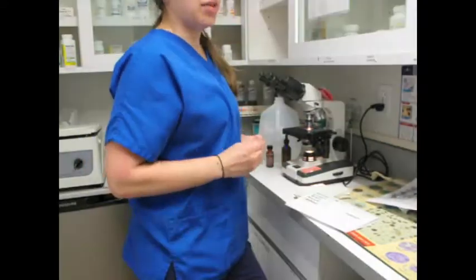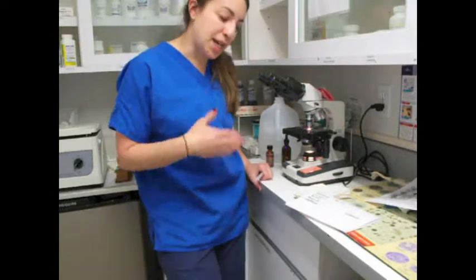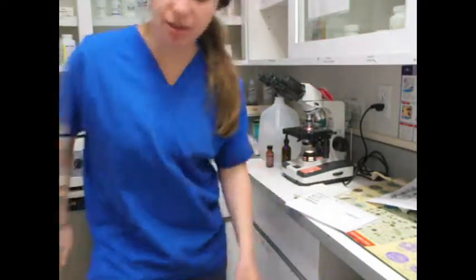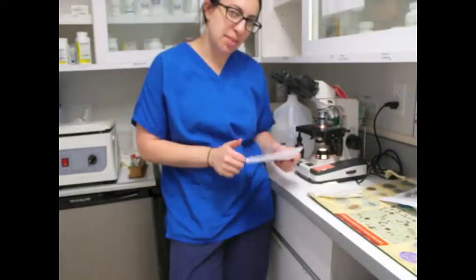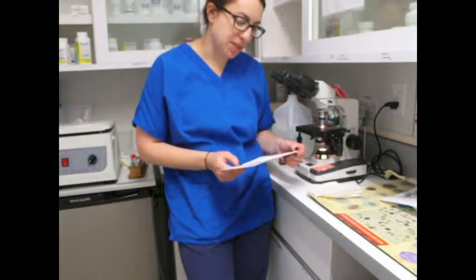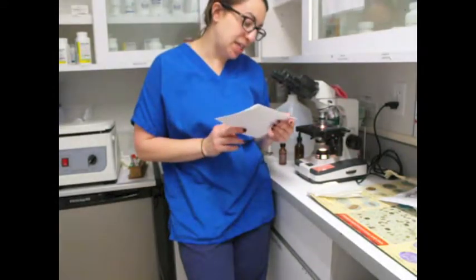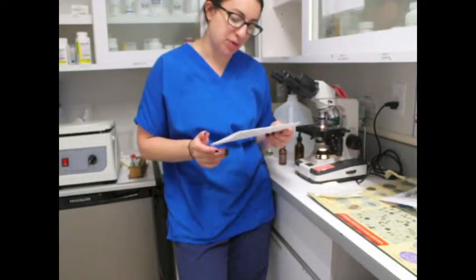So now, since I've counted 10 in that field, I'm going to go on to the next field and count 10 more white blood cells and continue this process until I have 100. So I have finished counting my 100 white blood cells on my microscopic blood film slide. So I have come up with my tallies here. I have seen 85 neutrophils, 5 monocytes, and 10 lymphocytes.